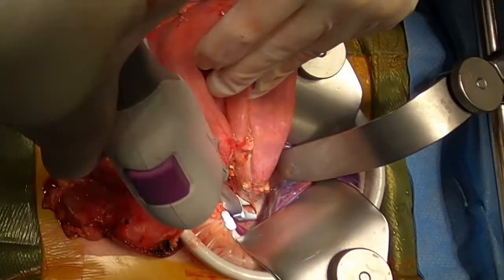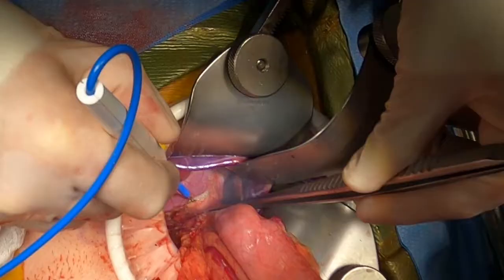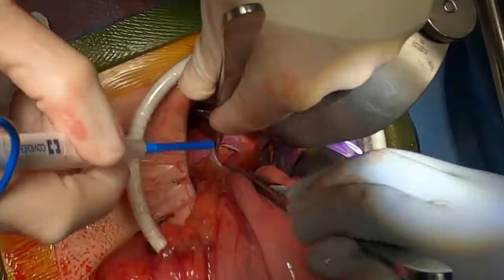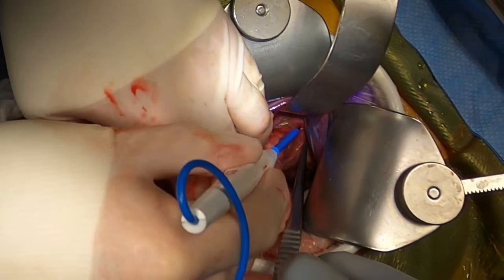Here, you can see the left gastric pedicle. Using electric cautery, the tissue is scored along the left and right cruces. Once the tissue has been adequately dissected, you see the nice release of the distal esophagus into the abdominal cavity.